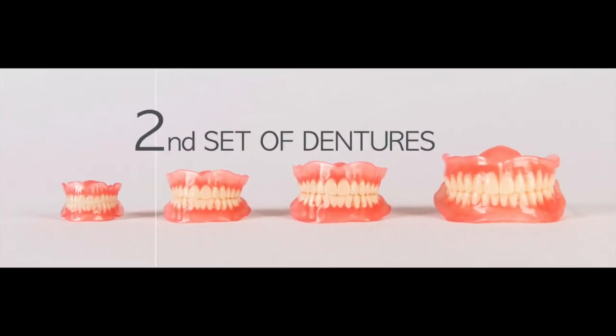Printed dentures have a huge advantage over conventionally processed dentures: making a second set is practically as simple as pushing the print button from the digital file. When a patient has accidentally lost or broken their denture, you can simply reprint it without doing all the procedures again. For example, this patient received their denture but then lost it. Since the digital print file was saved, we were able to reprint a second set and deliver it to the patient.